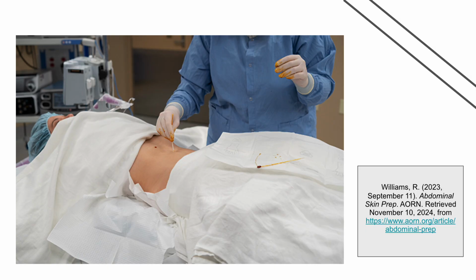The patient is placed in the supine position with the arms abducted at right angles to the body. Determine the intended site of incision. Begin at this clean site working outward. Prep sponges are used only once, as the same sponge is never used to go back over an area. Instead, a new sponge is taken. Cleansing is done on the skin surface area from nipples to mid-thigh level and down to the table at the side.